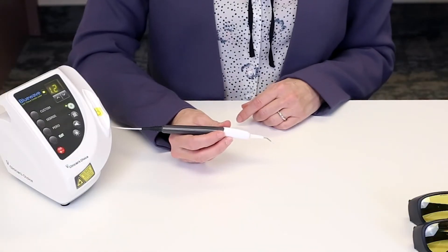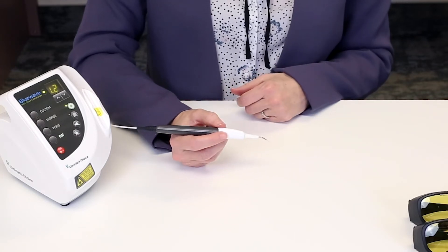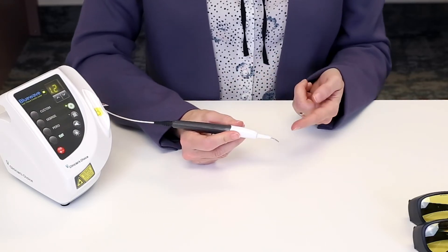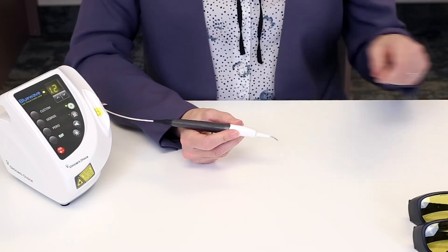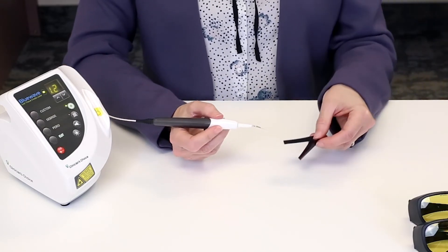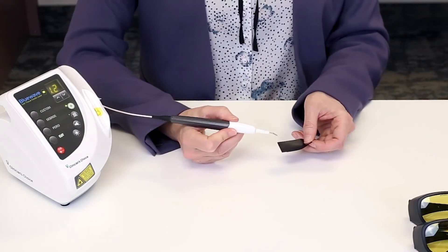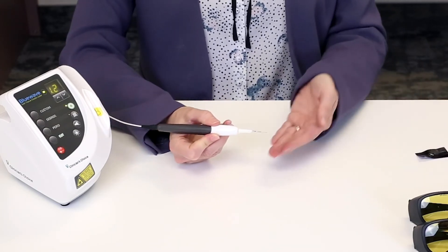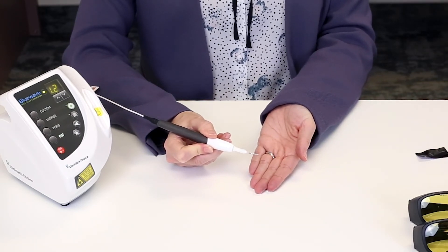Once your BlueWave laser unit is set up and ready to be used, you may find that for certain procedures it recommends using an initiated laser tip. To initiate the laser tip, make sure it's on the unit fully and your unit is on and in the green ready mode. Take some simple articulating paper from your office, or that was shipped with the unit. Press the laser tip to the paper and activate with the foot pedal. You will see it starts to activate and cuts the paper. You'll notice that the end of the tip is now black — it has been initiated, which will allow you to cut or ablate tissue.